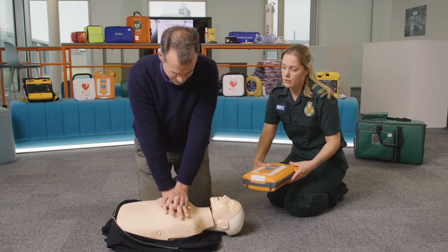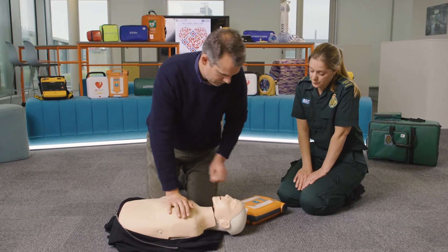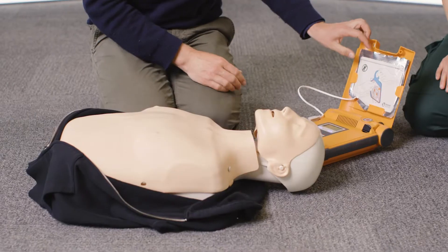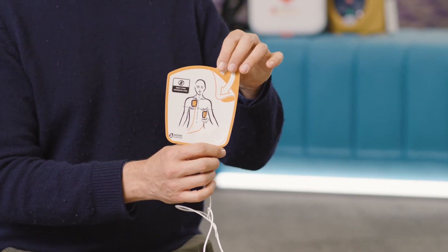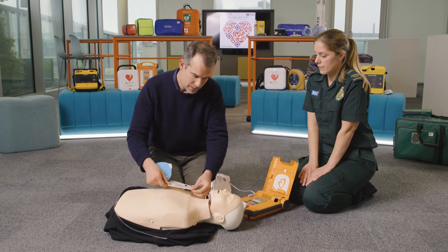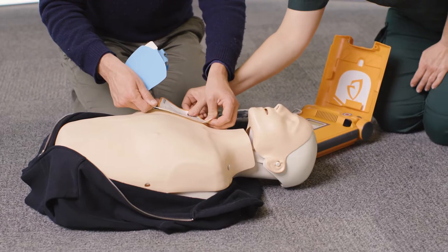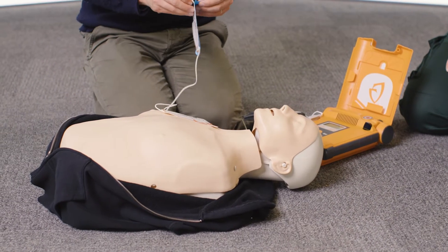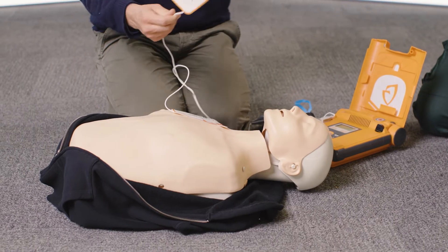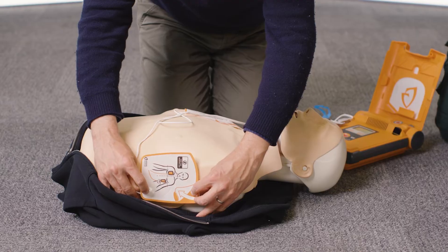Once the defibrillator arrives, open the lid and take out the pads. Each pad has a picture of exactly where it needs to go. I'll put the pad there — is that the right position? Yes, that's correct. And then the left lateral side, just under the left arm. Okay, just under the arm about there? Yes, that's right.